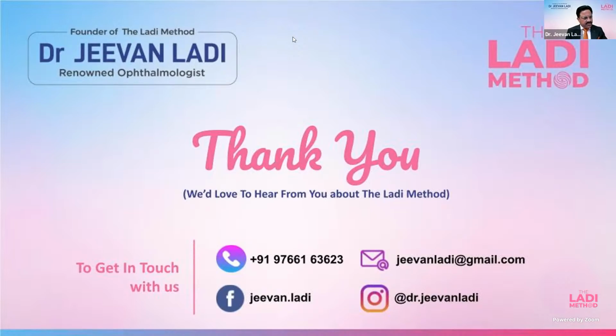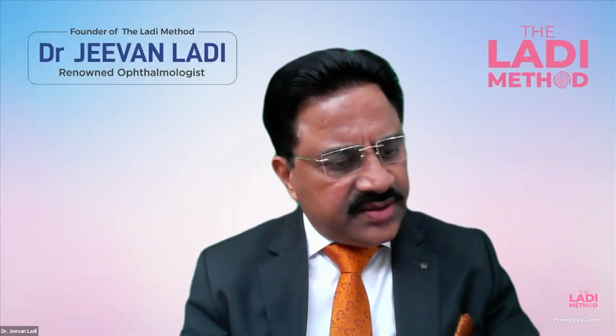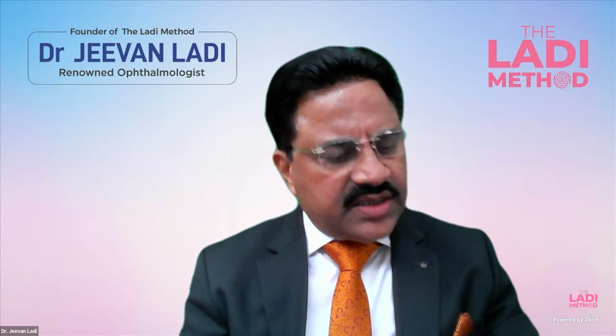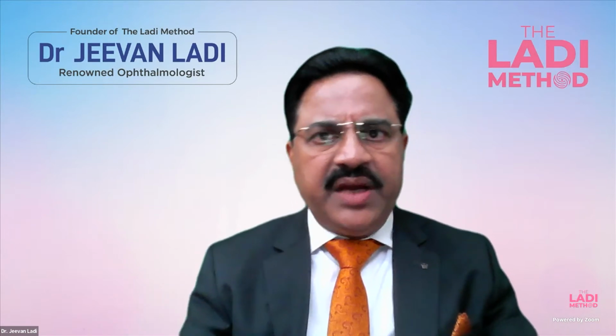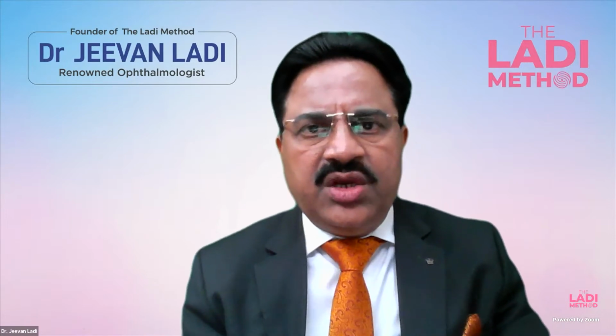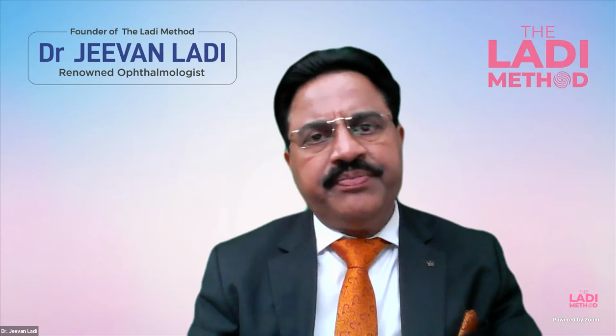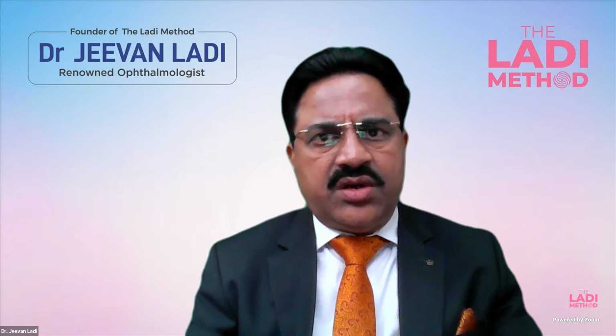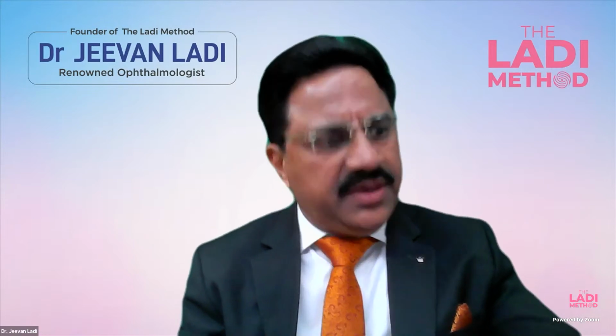So the question from Dr. Ranjit Mukherjee from Mumbai. He's a very famous surgeon doing anterior and posterior segment surgeries. And what he wants to know is whether these advancements in the formulas which are there can be incorporated. Yes, it can be. We have studied only Universal 2 of Dr. Barrett, but you can try it with the Hill RBF. You can try it with Olsen, and you can try with the other methods which are available.